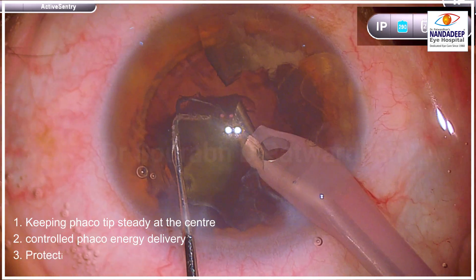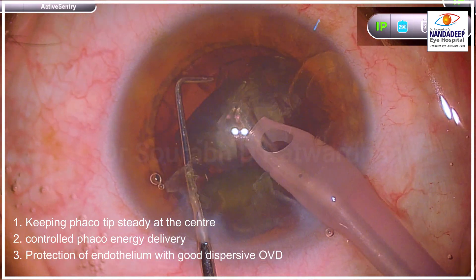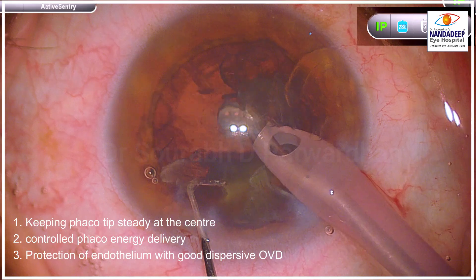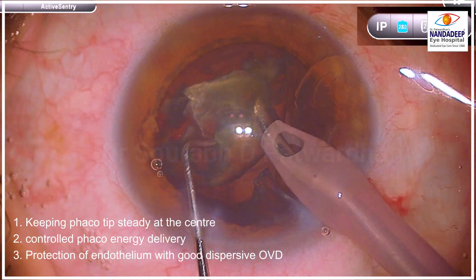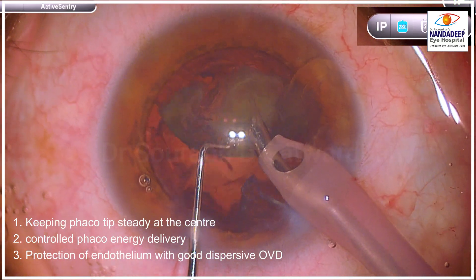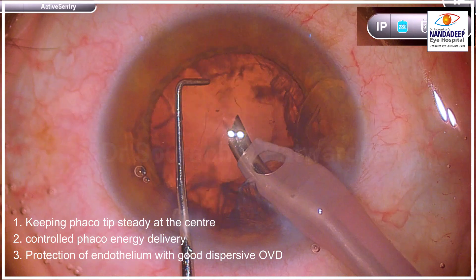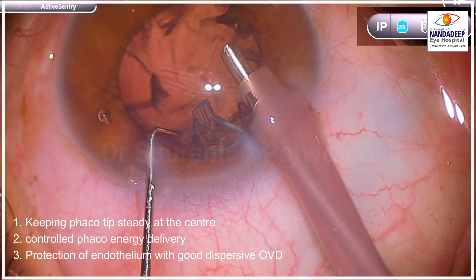The three important things, apart from large CCC and nucleus prolapse, are: keeping the tip steady at the center, controlled phaco energy — so you should have very good control on your foot switch — and always protect the endothelium with good dispersive OVD for this technique. My choice here is Hyalcoat, which is a combination of chondroitin sulfate and sodium hyaluronate, which protects the endothelium very nicely in this technique.